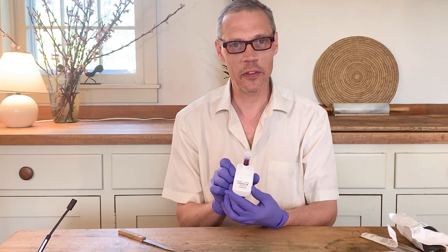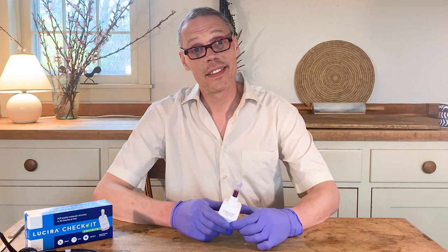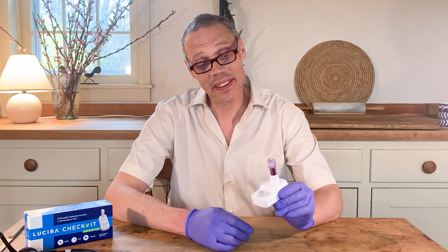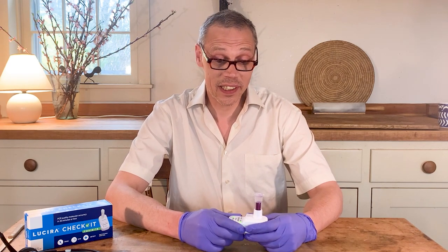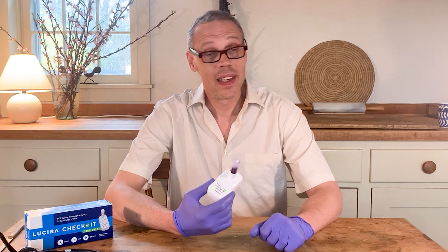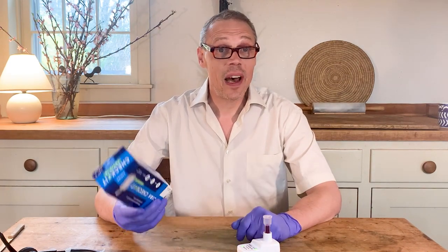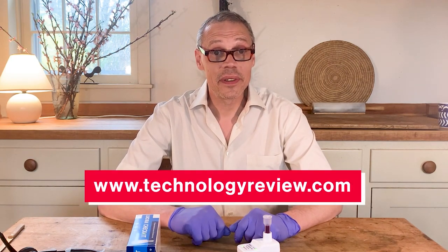Do not move the test unit until 30 minutes is up. I'll just put that down very gently. I'm back — good news, my COVID test is negative. This test from Lucira has an accuracy of about 95%, meaning it catches 19 of 20 real COVID cases, so hopefully I'm not the 20th one it doesn't catch. The big question for these tests is whether they're going to help end or control the pandemic in the US. At $55 it's a little expensive — not something I'd be willing to pay every day, not even every week. What I am going to do is buy one and keep it on the shelf, so if I feel sick I can test myself at home and get a quick answer in about an hour without going to the doctor or waiting in line for a test. Check out our review of all the COVID tests at technologyreview.com.